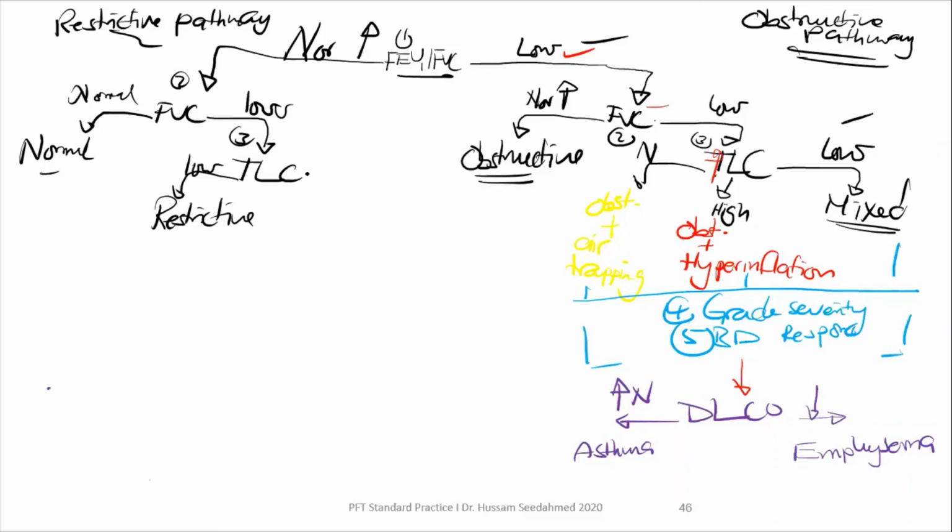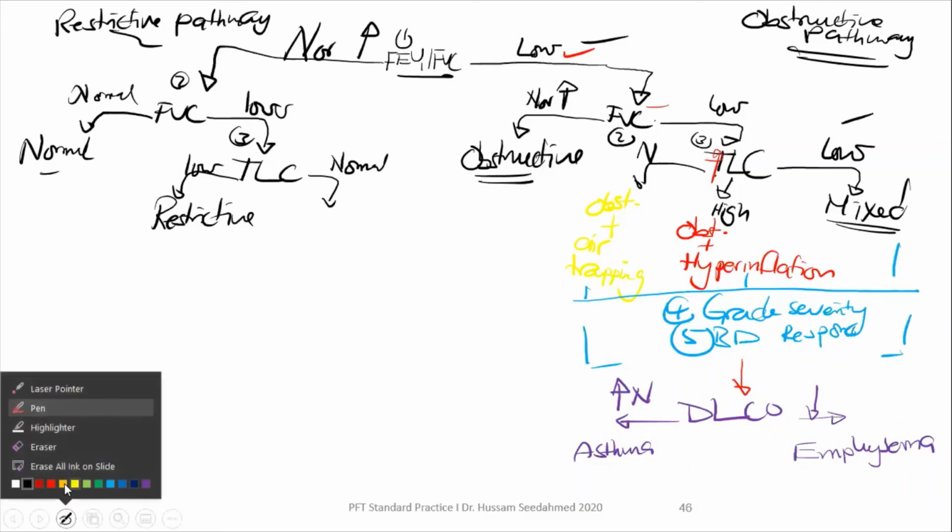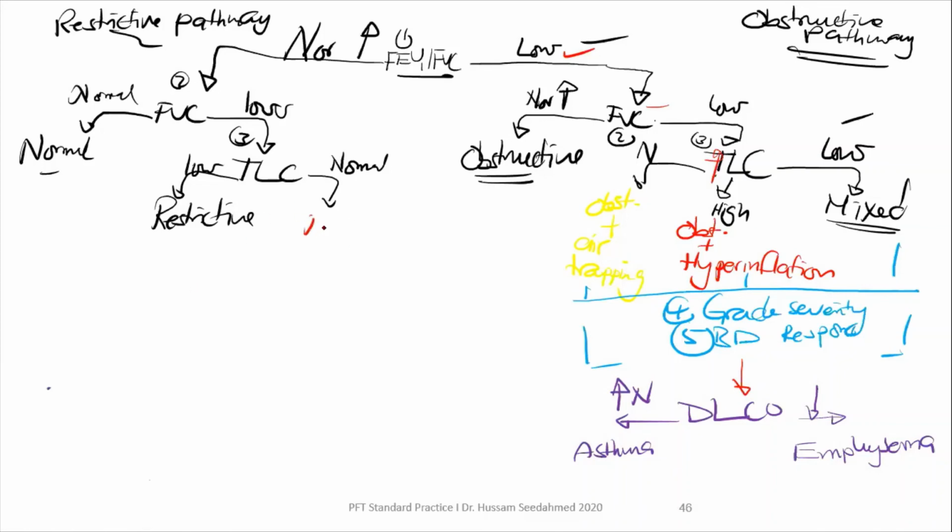طيب إذا TLC يعني normal، أنا عندي البيشنت ده الريشيو بتاعه normal or high لكن ال FVC بتاعه low. The FVC is low حاجة ماشية مع restriction لكن ال TLC is normal، فده بقول عليه أنا this is known as a non-specific pattern. إذا أنا عندي obstructive واضح جدا، restrictive واضح جدا، وعندي mixed، وواحد فيما بين اللي هو non-specific pattern.